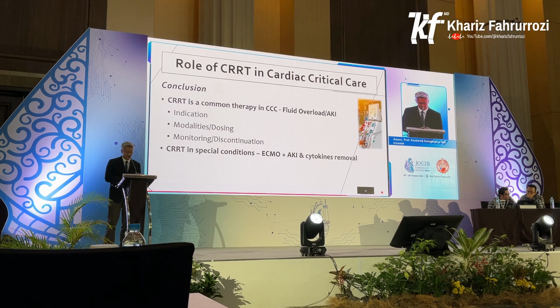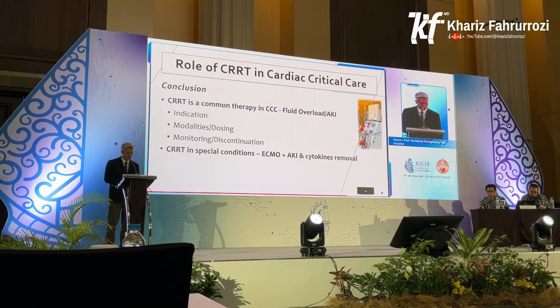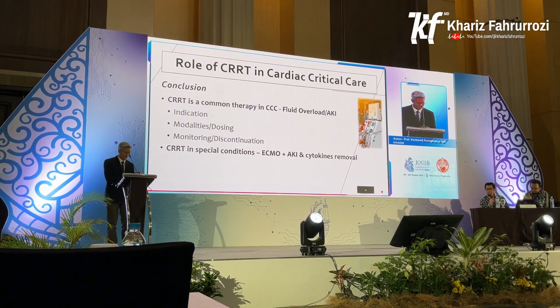especially in those patients with fluid overload or with solute problems during toxic exposure. I already mentioned the indications, modalities, dosing, how to monitor, and when is the appropriate time to discontinue CRRT. And the last one, I already mentioned CRRT in special conditions, especially in those patients on ECMO and also cytokine removal. Thank you very much for your attention.